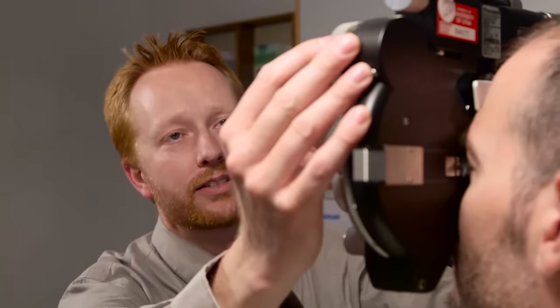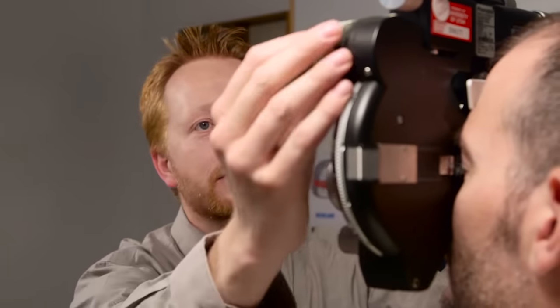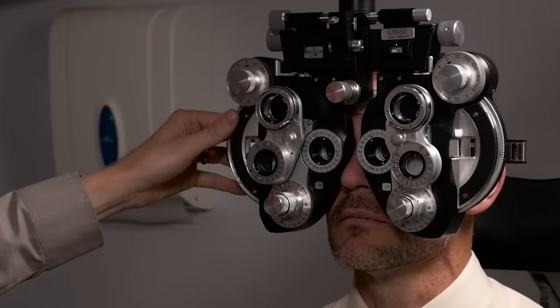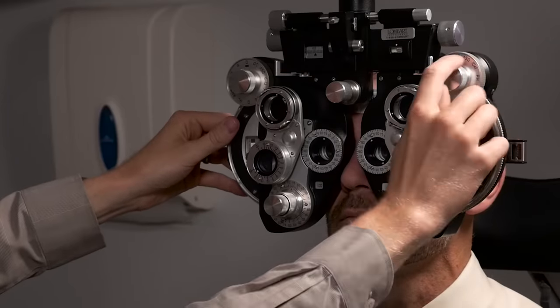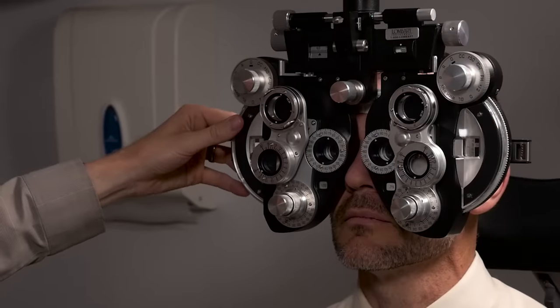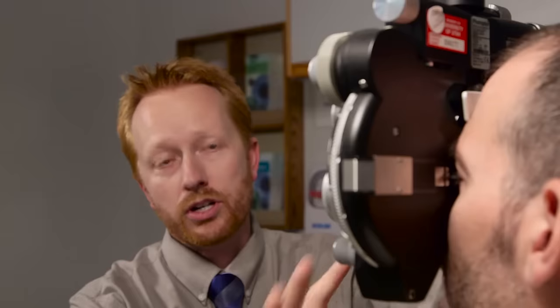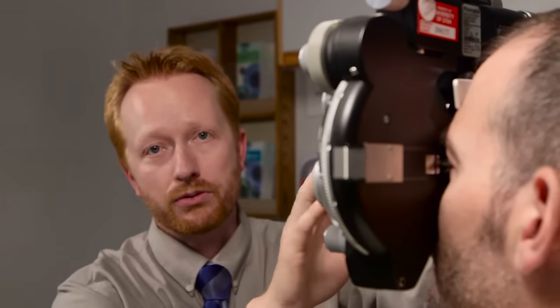Okay now in this case we're going to start with the right eye and then go to the left eye. In order to do so you turn this knob so it reads OC that means to occlude the left eye. So currently both of his eyes are open but you can only see through his right eye because the left eye is occluded.